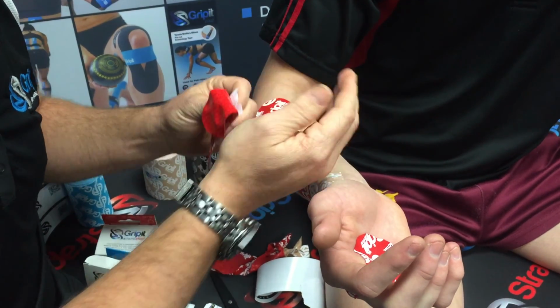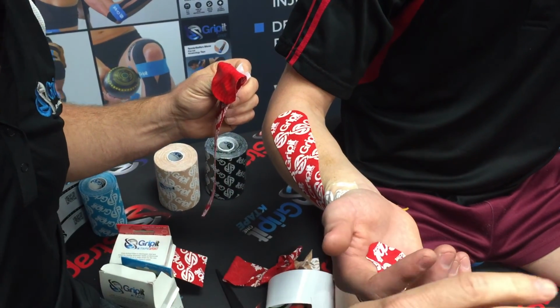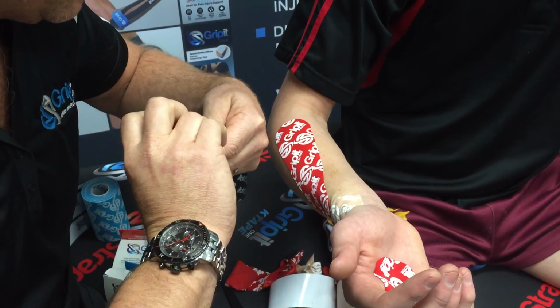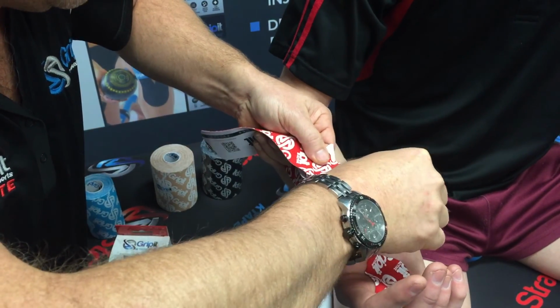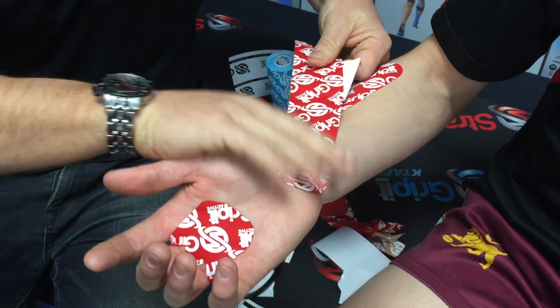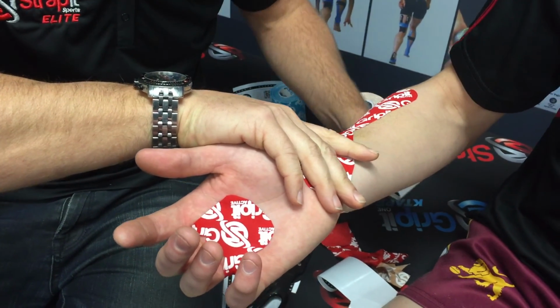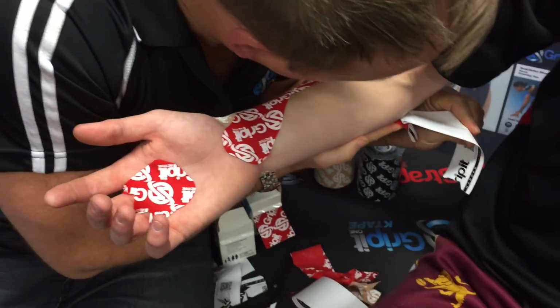Okay, and then we're going to wind up the tape under tension. So basically, Daniel will always want to come back into a supinated position, which is a better position for these tendinopathies. And he'll feel this any second now once I apply the tape. All right, so we'll just get our end going here. Okay, so you can anchor here. Okay, and so I'll just set up this tape here. So again, we're going to really wind him up here. So you can see I've got about, it's a fair bit of stretch there. Okay, and this anchor point can go to where I'm applying it now.